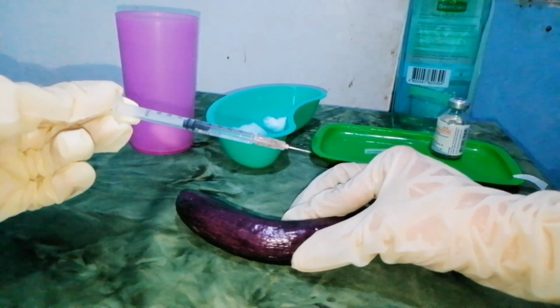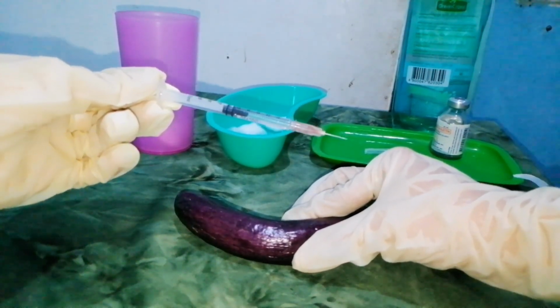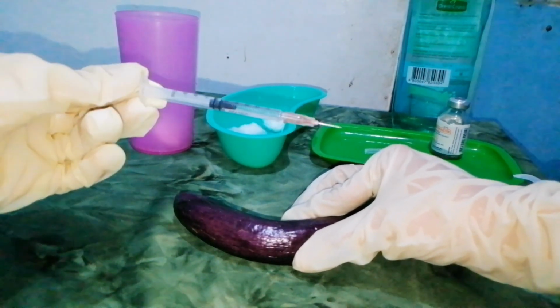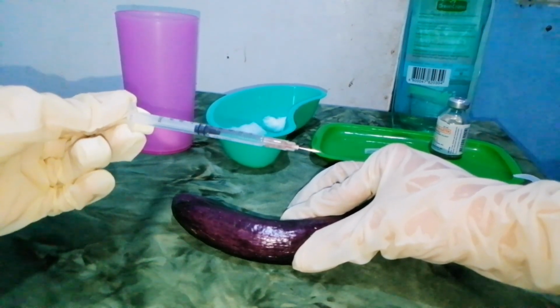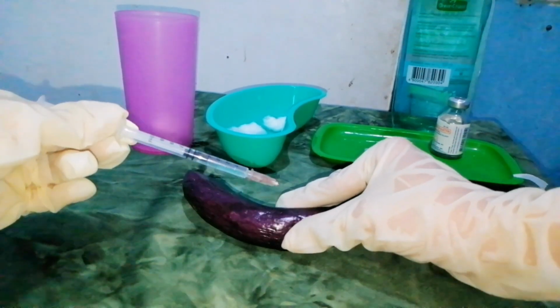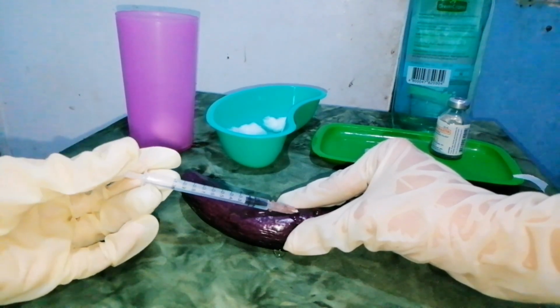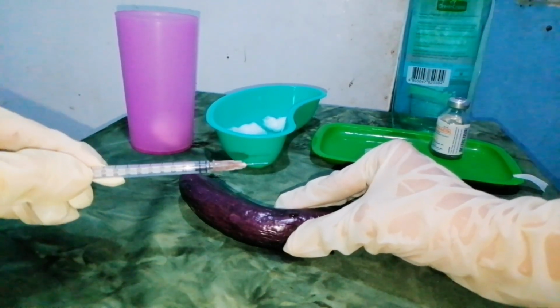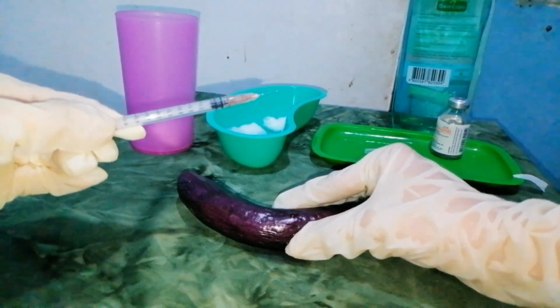For example, if using the ventral forearm, grasp the client's dorsal forearm and gently pull it to tighten the ventral skin. And insert the tip of the needle enough to place the bevel through the epidermis into the dermis. And stabilize the syringe and needle and inject the medication carefully and slowly so that it produces a small wheal on the skin. And withdraw the needle quickly at the same angle at which it was inserted. Activate the needle safety device and apply a bandage if indicated.